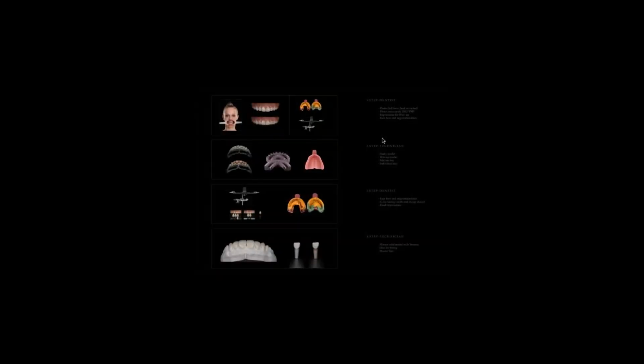Okay, so this is my protocol that I always do with my cases, and you can see that first I go with the intraoral pictures, portrait pictures, and then, based on these portrait pictures, I always prepare my models, and I do the wax up. And then after the wax up, I'm doing the mock-up.